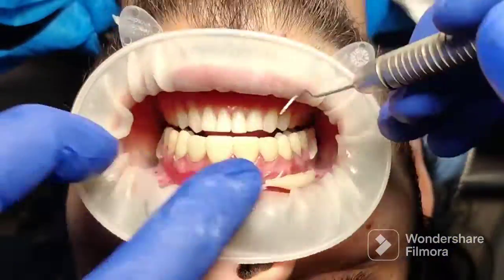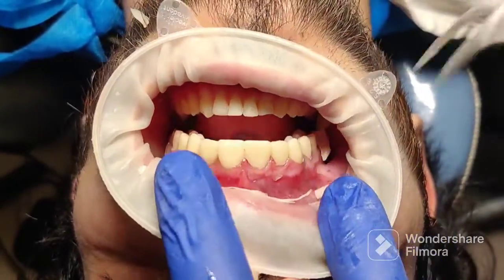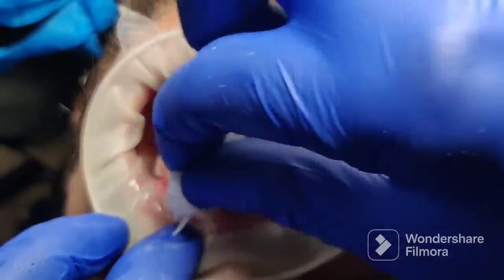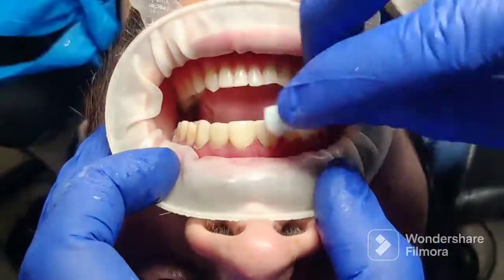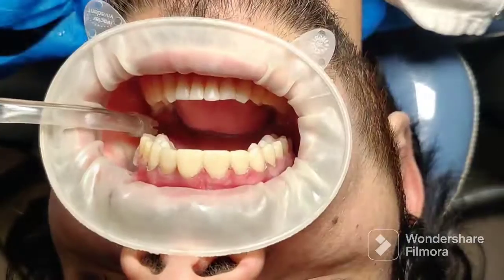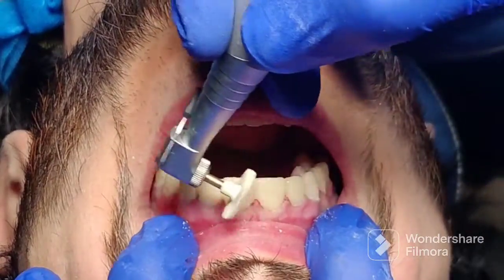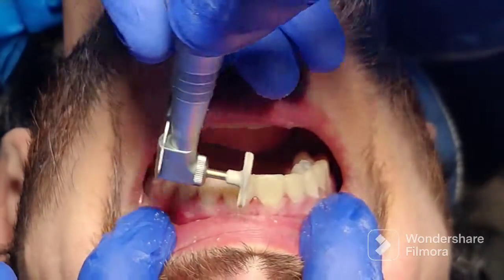After that, try to remove all the excess, and then with a wet gauze you want to remove the oxygen inhibition layer which is sitting on top of these resin veneers. If you don't remove this inhibition layer properly, you are going to see that these veneers will discolor very quickly — within a day or two.